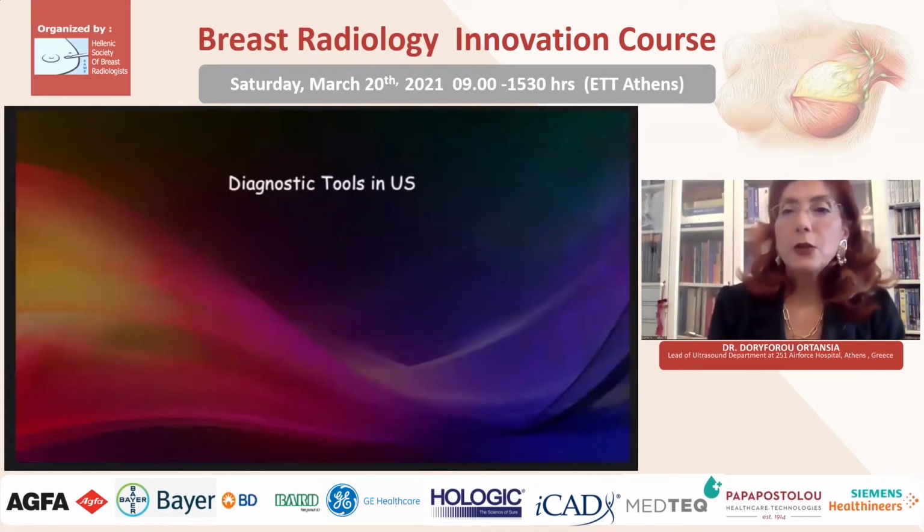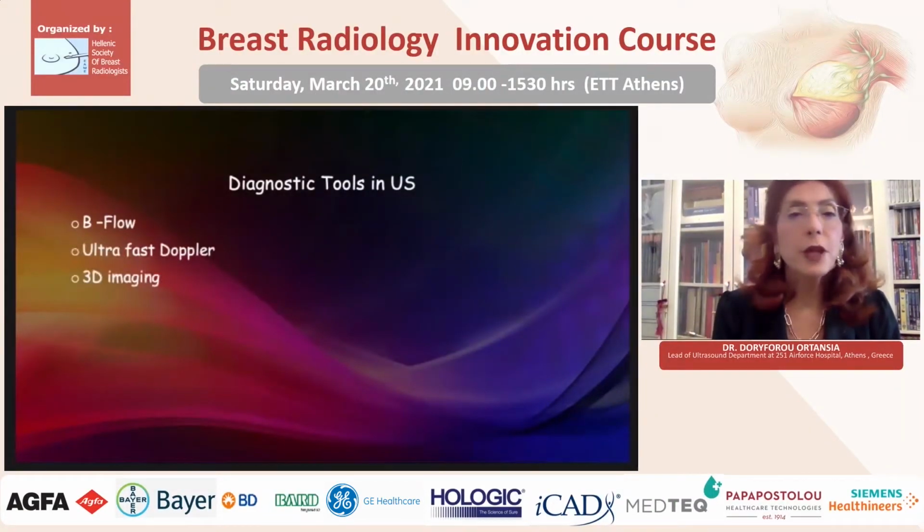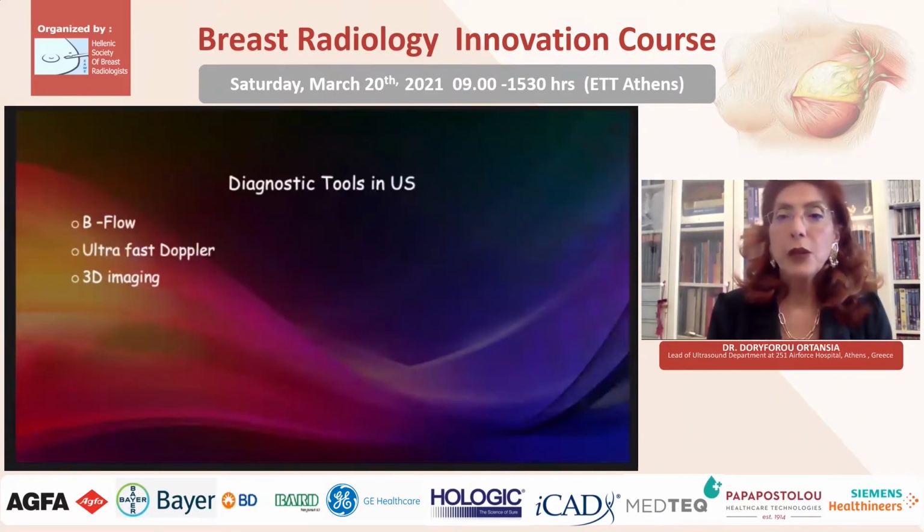So over the last 2 decades, there has been a revolution in the area of ultrasound technology in medicine, and new software has improved the visualization of lesions, like B-Flow, ultrafast Doppler, 3D imaging, which of course allows better visualization of a lesion in different planes and allows better characterization of the lesion and the surrounding tissue.